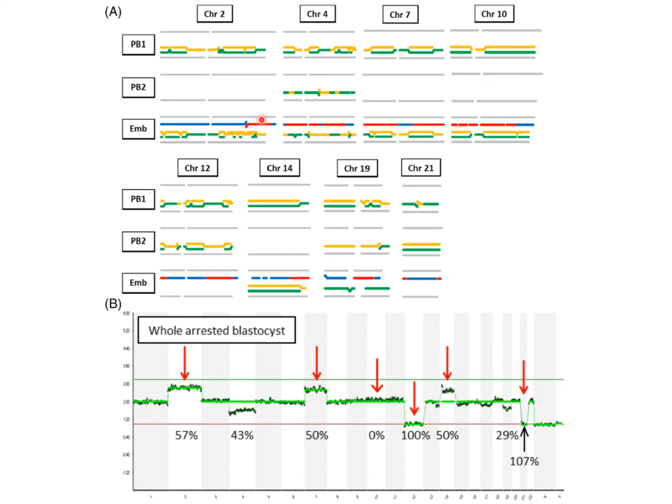Now in the second polar body, if we just focus on chromosome 4, which is segregating chromosomes during meiosis normally, we have a single copy of a chromatid in the second polar body and a single copy in the zygote, along with, obviously, since this is an embryo which underwent fertilization, although it arrested, the single paternal chromosome indicated here in red and blue.